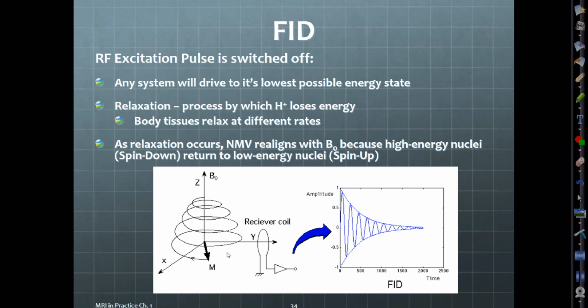Remember, it's rotating along that transverse axis, so as it realigns, it just kind of starts to loop up, loop up, loop up, loop up, back to B sub 0, because you still have that secondary spin called precession. So it kind of realigns in this kind of wonky fashion right back up, B sub 0. And if you just turn this little diagram on its side, see how it kind of correlates to our free induction decay.